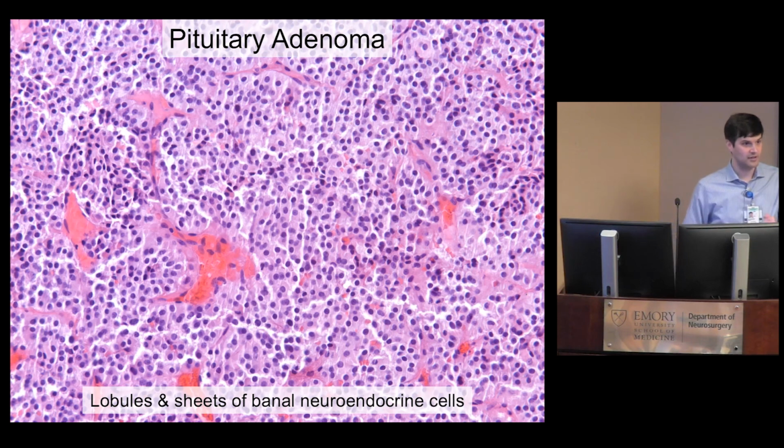How often do you see those atypical adenomas? In published series, they were 2 to 3%, and in our experience, really the key is how do you interpret your P53 immunostain, and this was what caused that category to be so hazy to begin with. Because if you say an astrocytoma has a TP53 mutation, if you do a P53 immunostain on that, you'll see a bunch of overexpression.